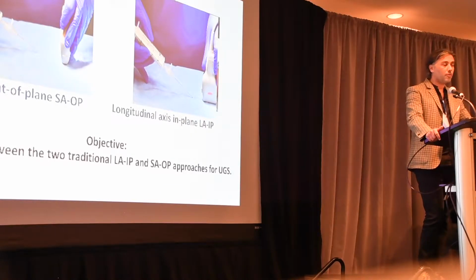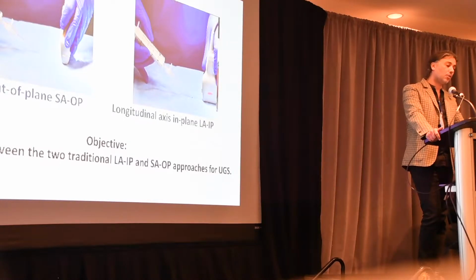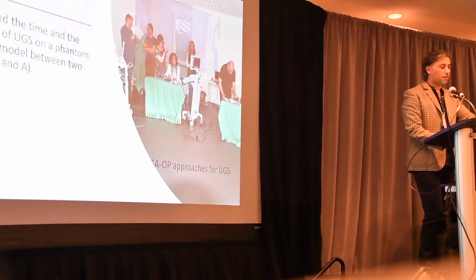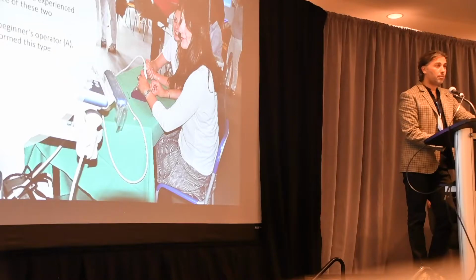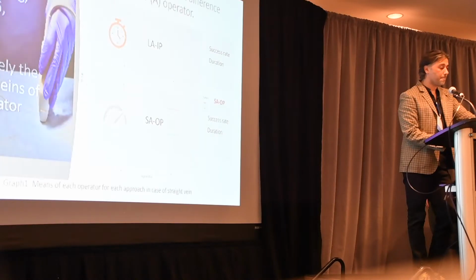So we are going to talk just about this first study evaluating the two classical approaches. It means short axis out of plane and longitudinal axis in plane. We compared them with a small study. We compared the success rate of ultrasound guidance on a phantom ultrasound training model between two operators. The first operator was confirmed, experienced, and the second had never performed this type of treatment. The test consisted of puncturing under ultrasound guidance, 10 times successfully, the artificial veins of the simulator phantom.